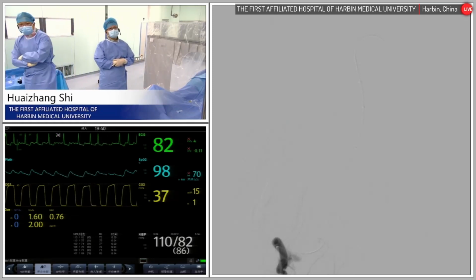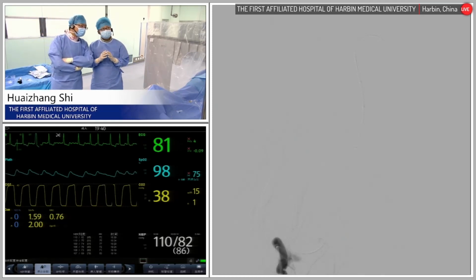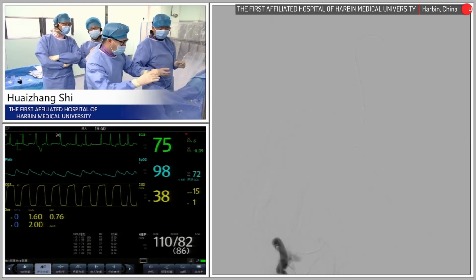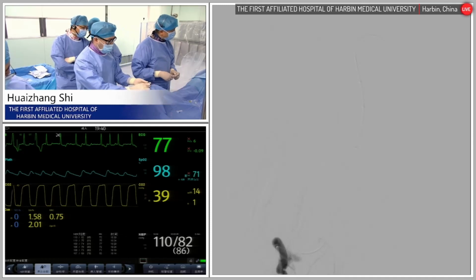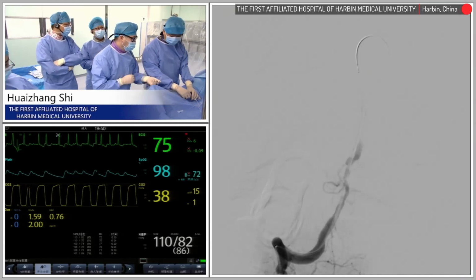Open. 23. Yeah. If it's a coronary intervention, we may use some imaging devices to measure, like the diameter of the stenosis and the area. Give me the roadmap. But in this kind of treatment, you always use DSA to do this kind of measurement, right? Sure. Yeah.